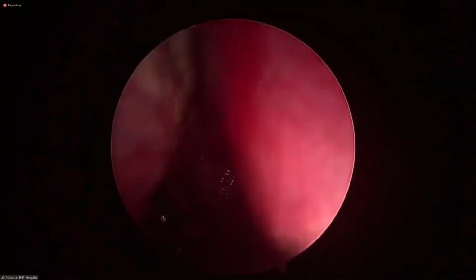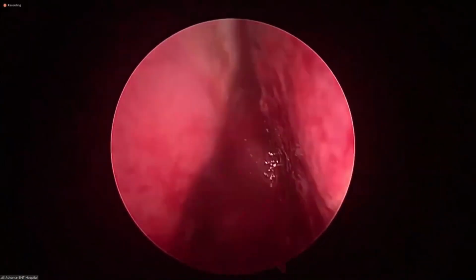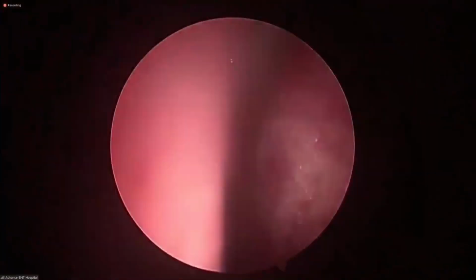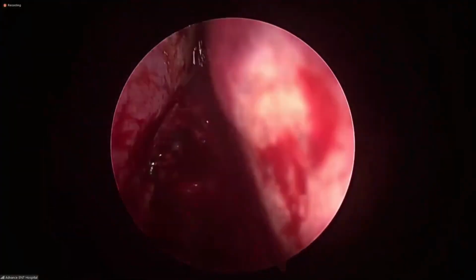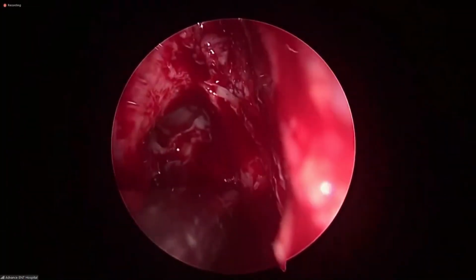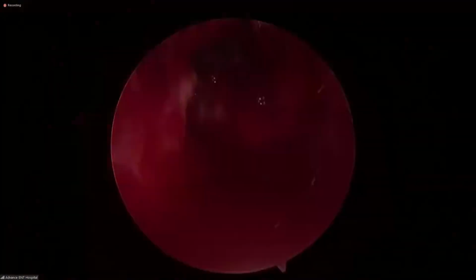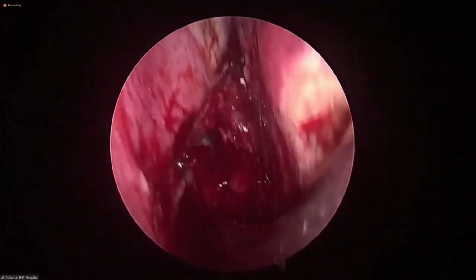Could you see? It is a large cell, sir. This was attached posteriorly. Just I will be making the opening narrow again, from behind. It was not attached anteriorly. That is important. Let me show you once again. I will tell you, everybody.